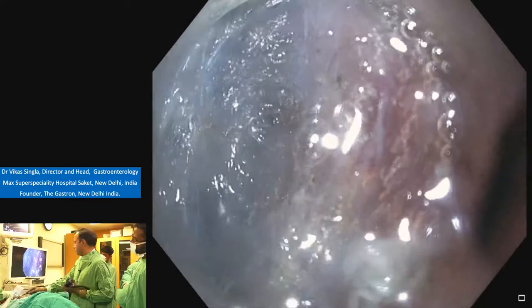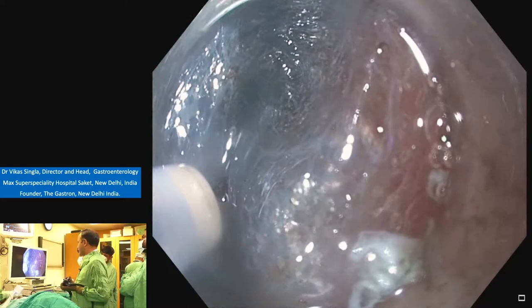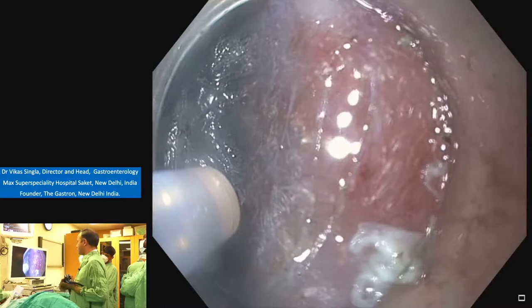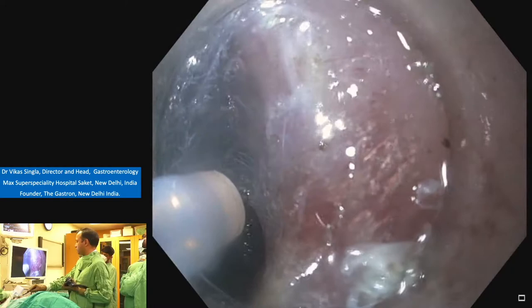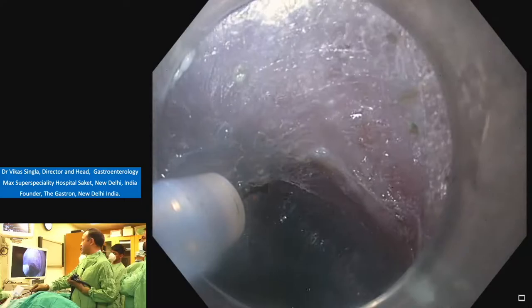On the right side we can see it's the muscle layer and on the left side is the mucosal layer. We are keeping the line of dissection vertical, starting at one edge, making a hole, then engaging the fibers, and then using the up knob, we are going in the other direction, cutting fiber very slowly. It's essential to dissect on the margins, otherwise the tunnel will become narrowed.